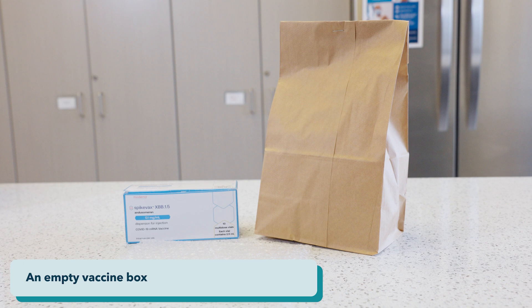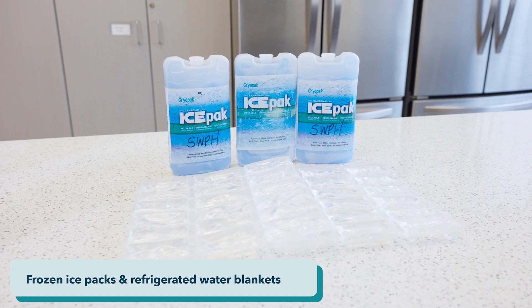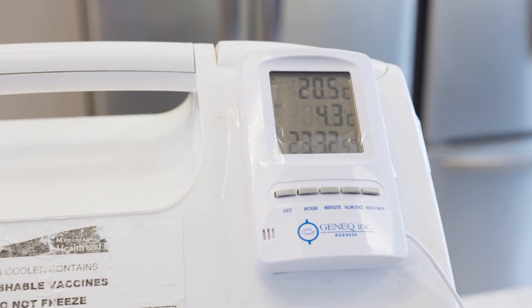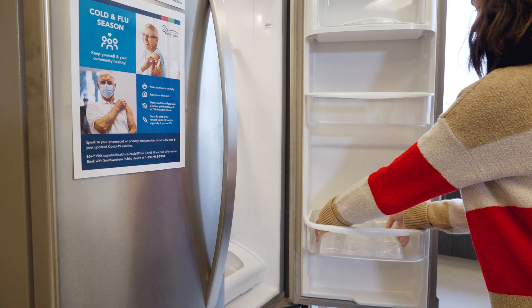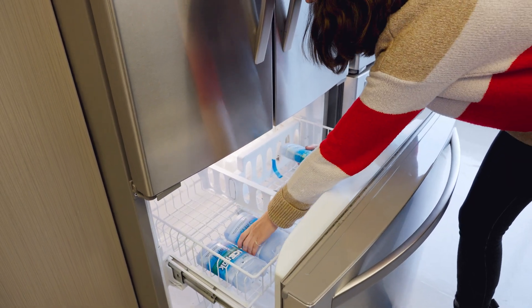You will also need an empty vaccine box, frozen ice packs, and refrigerated water blankets. To condition a cooler for vaccine storage, you must lower the temperature of the cooler before you store the vaccine for transport. Please note, this can take up to an hour to drop the temperature enough to be between two and eight degrees, so leave yourself lots of time. A temperature between three and five degrees is ideal.